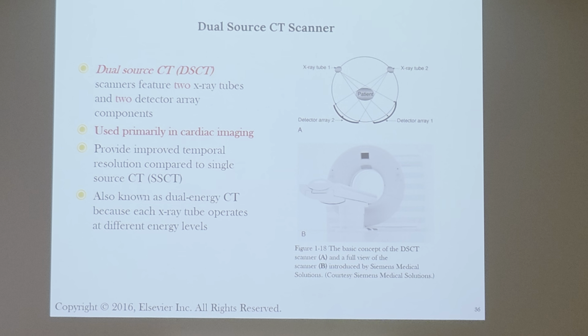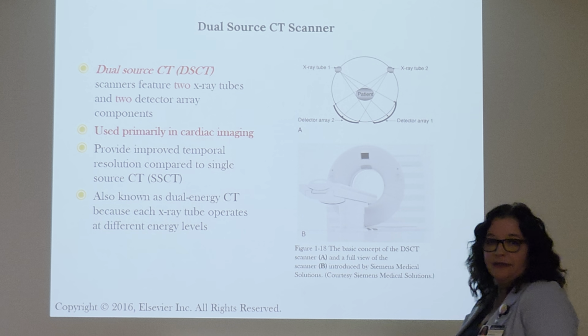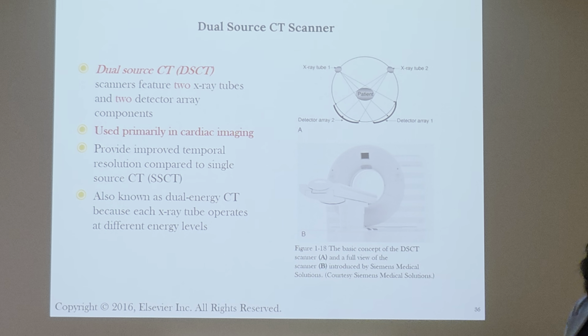Can we open up the tube and replace an anode disc? What do we have to replace if our anode is damaged? The entire thing. The entire x-ray tube. And if your x-ray machine is down, can you do patients? You can't do patients, then what happens to you?